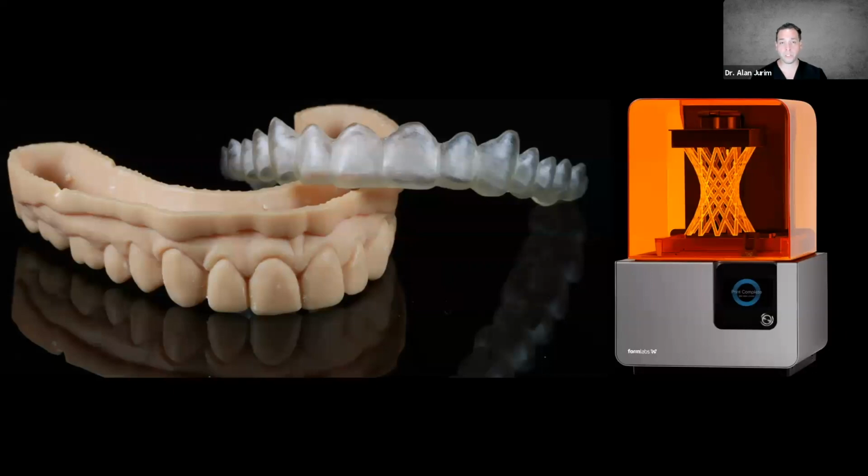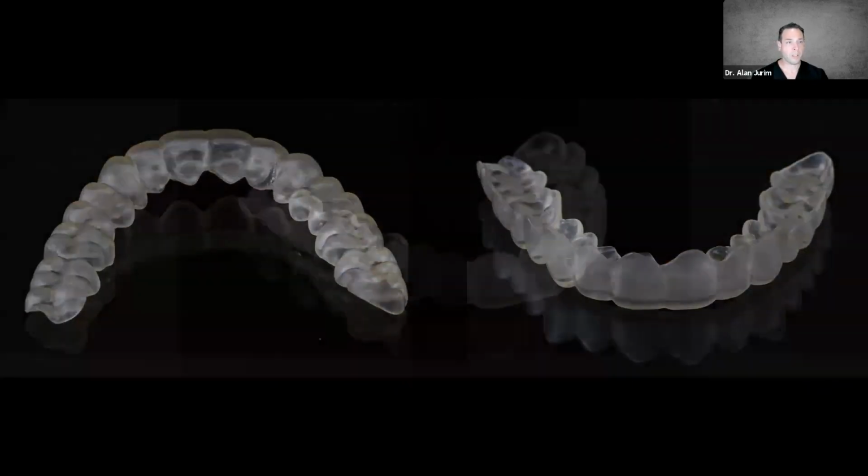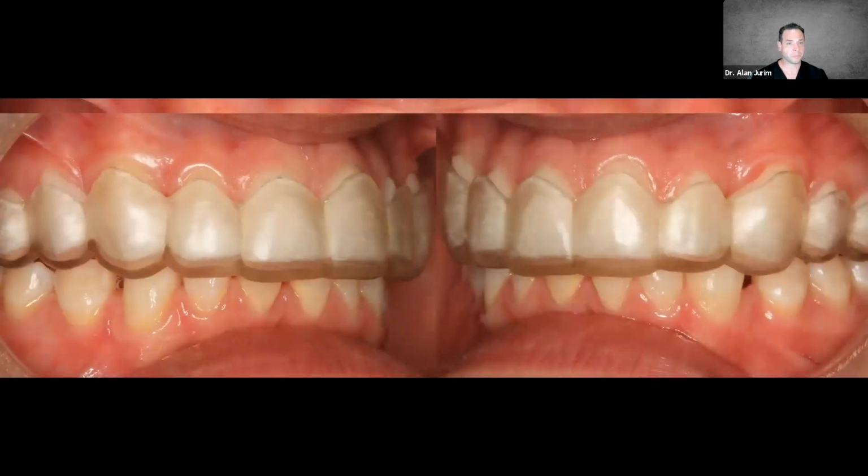We also have other patients who were in a motor vehicle accident and broke 2 of the units. So we can go back in time and copy over the data, copy over the smile that we used before. So 3D splints and the final scans are incredibly powerful, incredibly productive for the practice. And it also allows us in the future to have that information to refer back to in case we need it. Here's a picture of the splint printed, and we can deliver this to the patient.